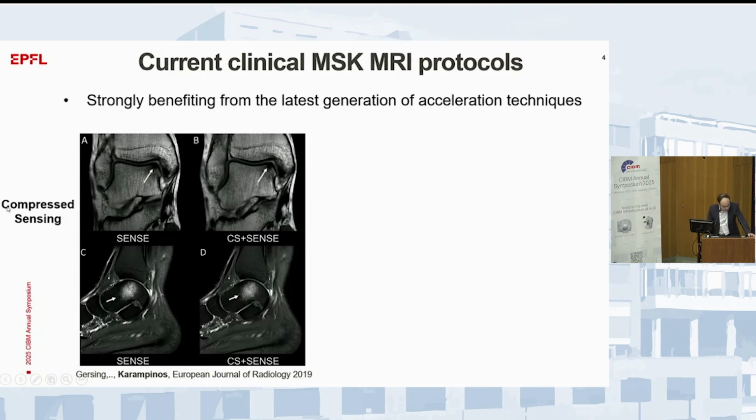So here is the paper by Mickey Lustig, and compressed sensing was in the early 2010s. And then we have here the methodology of compressed sensing really reaching the vendor.